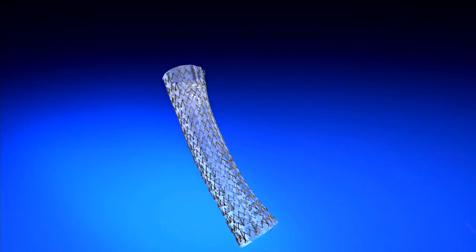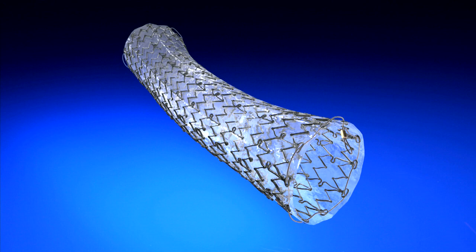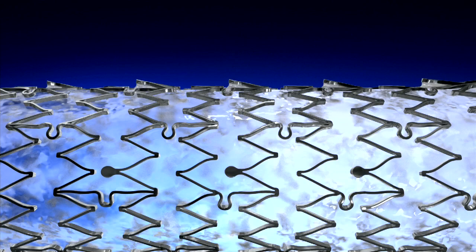The Endomax is fully covered in silicone, which helps provide flexibility and durability of the stent. Proprietary anti-migration struts run throughout the stent and are designed to reduce stent migration.